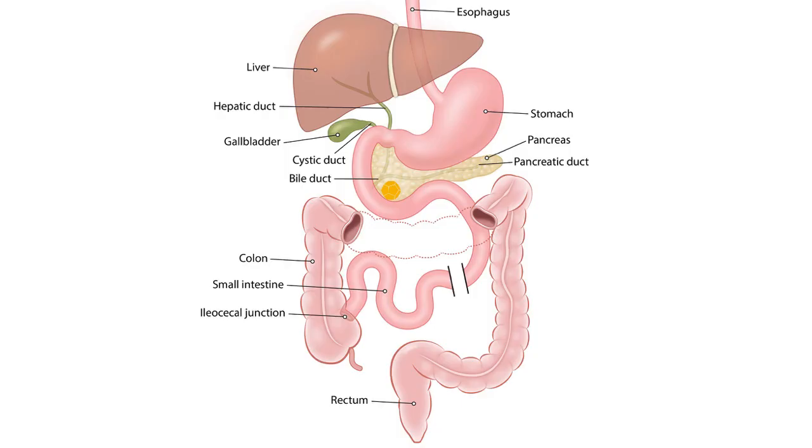So, let us see. Here is a mass in the pancreas that you can see. So, you pass the linear EUS scope down the mouth, pharynx, esophagus, stomach and duodenum, and once you find the mass under ultrasound, it is located in the pancreatic head. So, you decide to biopsy, you pass a needle under ultrasound guidance and take tissue. That is how we use the linear EUS scope.